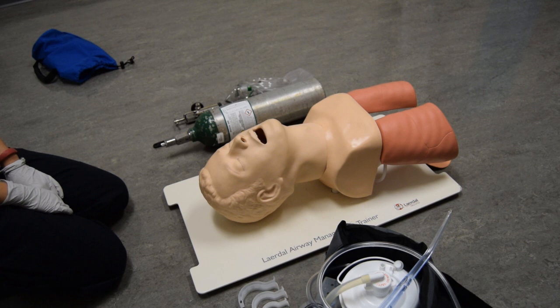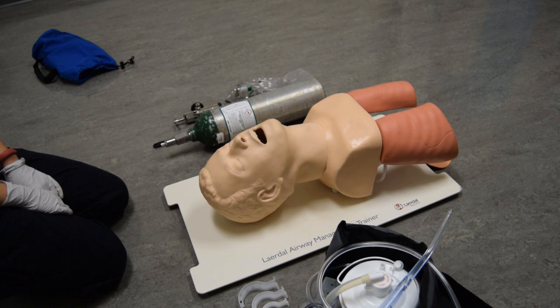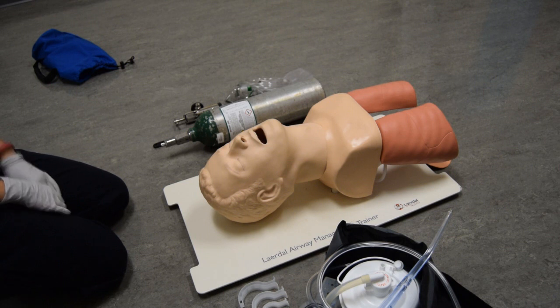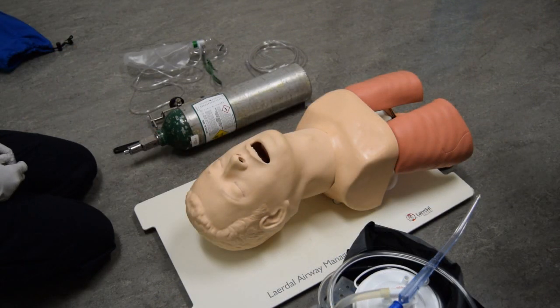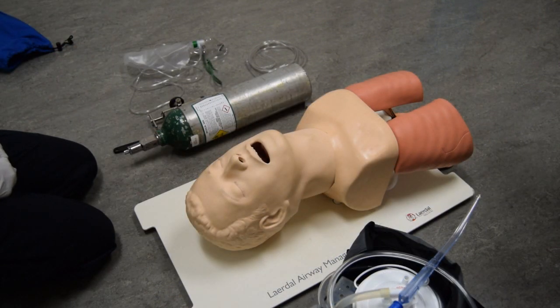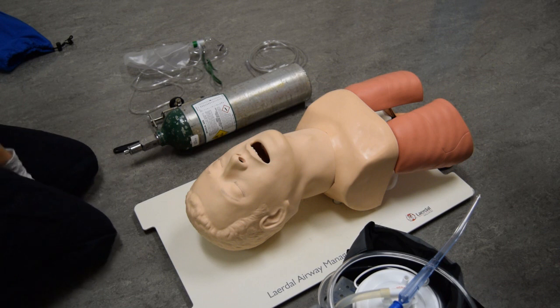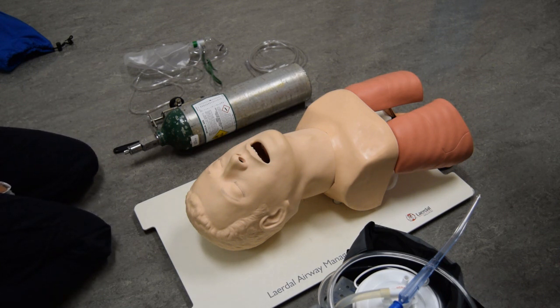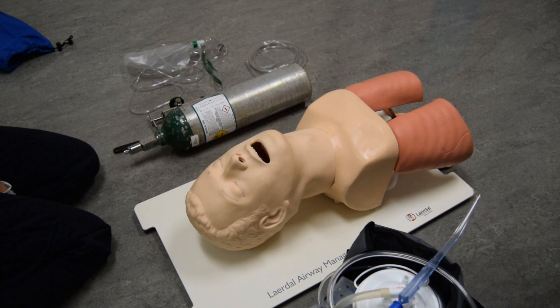At this time, please take two minutes to check your equipment and prepare whatever you feel is necessary. A 45-year-old male is short of breath. His lips are cyanotic and he is confused. You have five minutes to administer oxygen by non-rebreather mask.